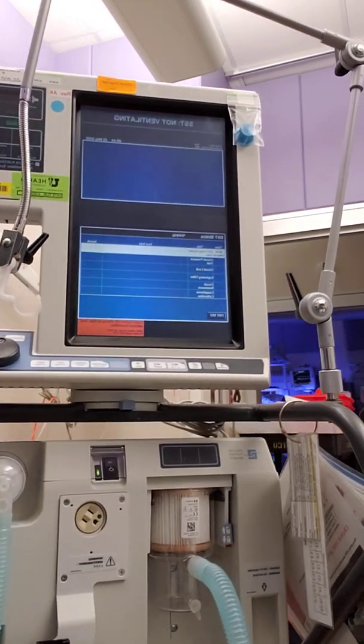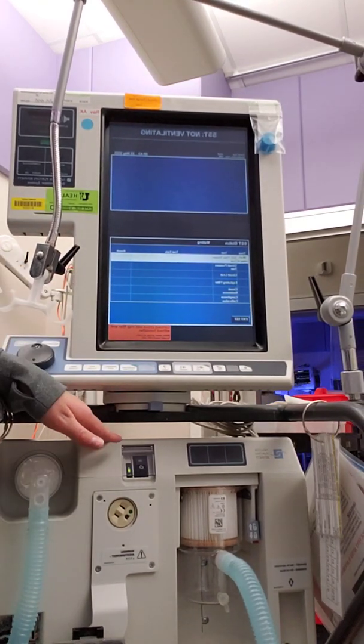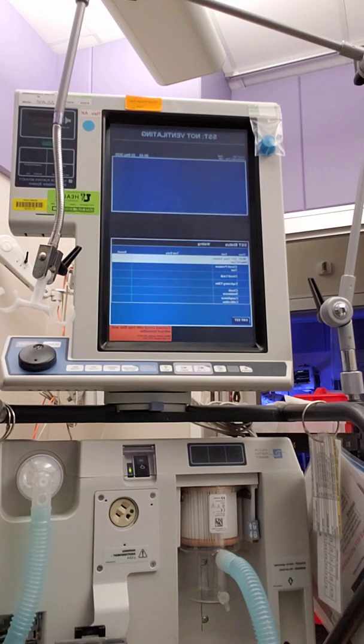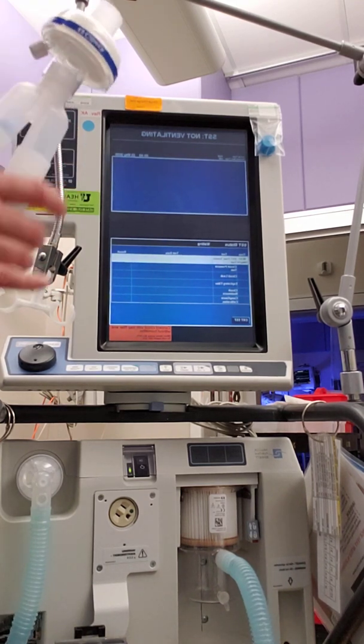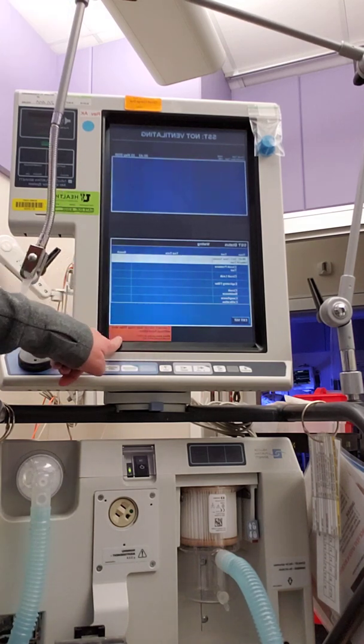Okay, if you guys can see, it says flow sensor. There's an internal flow sensor that helps measure the flow and volumes going on with the patient. It is doing that. Down here will be prompts you'll have to follow.